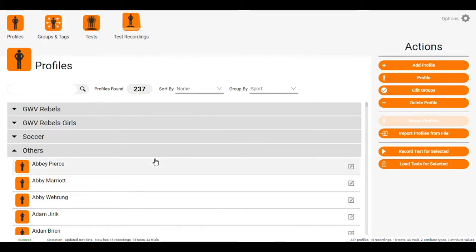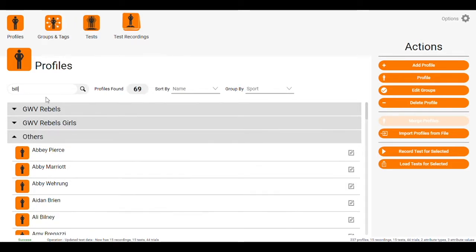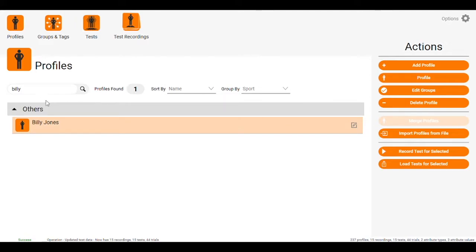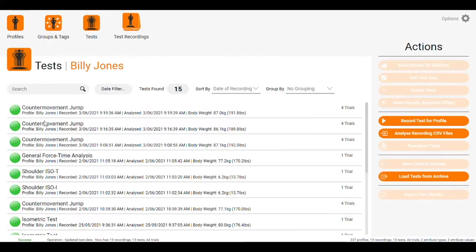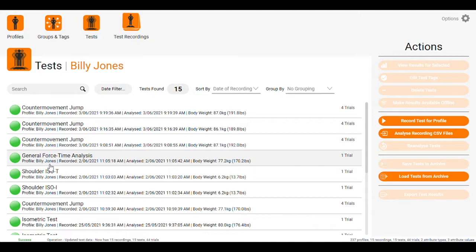Then we come across to profiles, search for the athlete that you're testing. We're going to search for Billy here. You double click on that athlete's name and it will come up with all their previous tests.